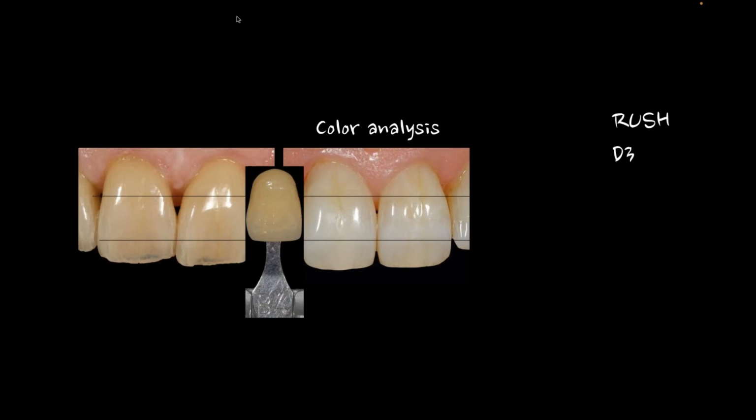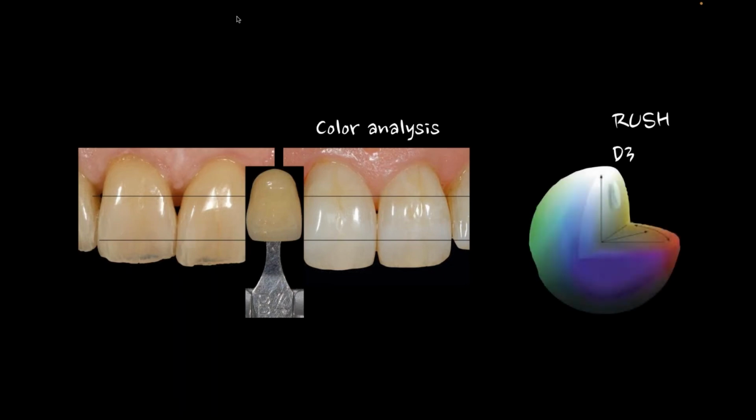The universal shade guide, I think that everybody kind of goes to here, I always joked over the years, is the D3. And that's the shade guide that I always say we use when nobody really understands what color it really is. They just kind of go to that D shade. So it's a D2 or a D3. Usually not. And I would argue that the shade D3 doesn't even really exist. I feel the same way about the C shades. I'm sure you've heard me say that before.